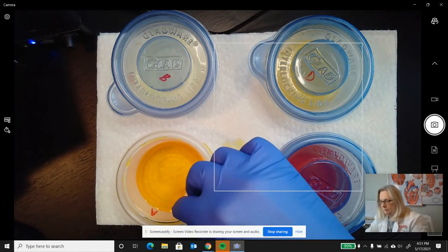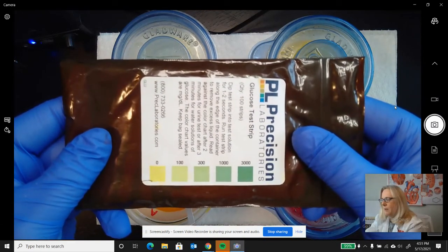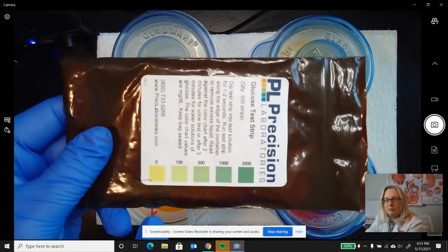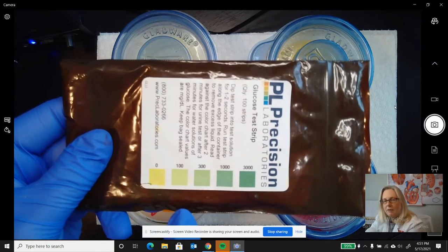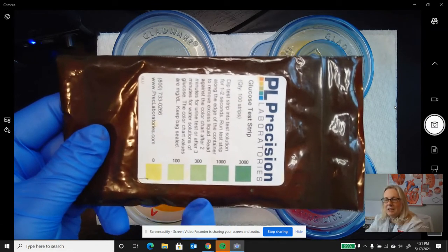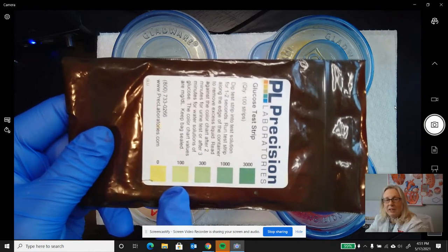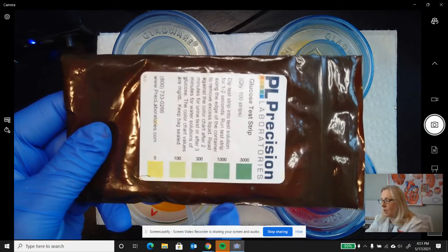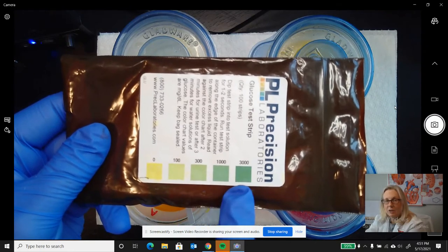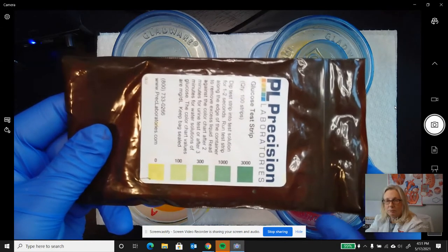So while that's sitting in there, this is my glucose scale that I have. You remember in the lesson yesterday, we had a glucose strip that went from 0.25, 0.5, 1, 2.0, right? This one looks a little differently because it's in hundreds. We just need to move the decimal point over 2 spots, okay? So this green one here would actually be 1.0. This would be 3.0, 10.0, and 30.0. So these are definitely high, okay? Really anything that isn't yellow is going to be high for glucose, okay?